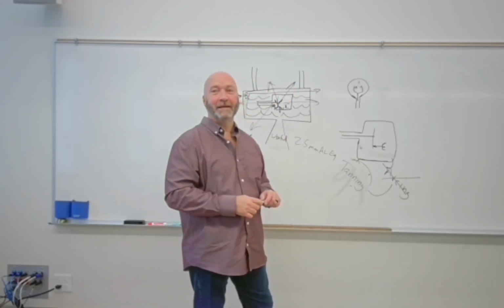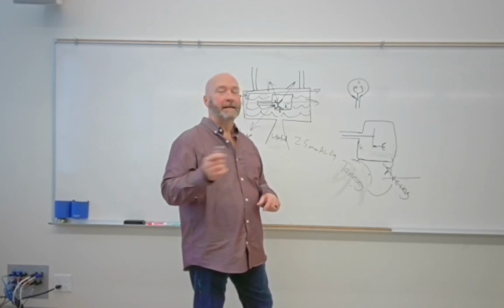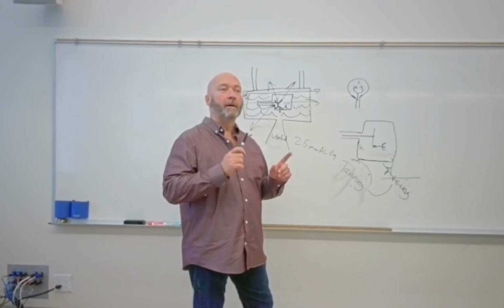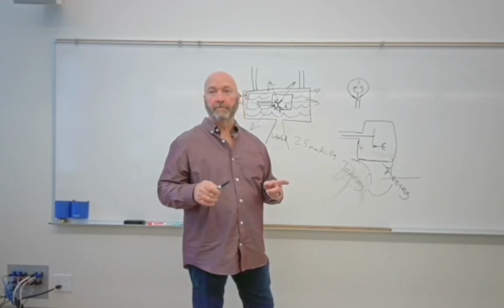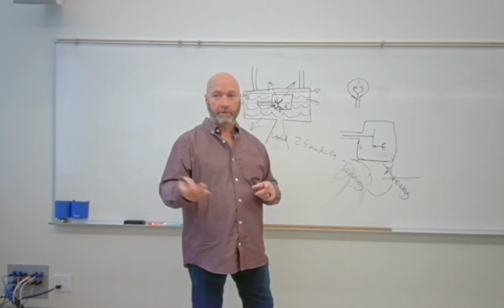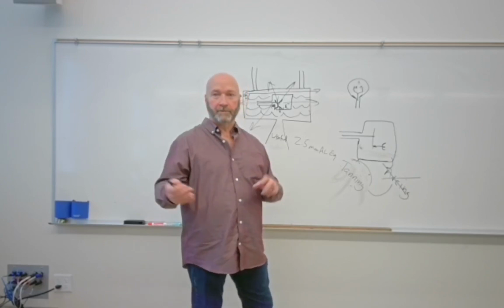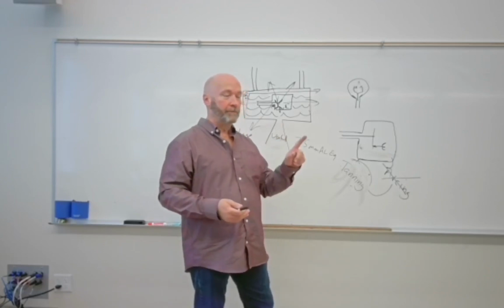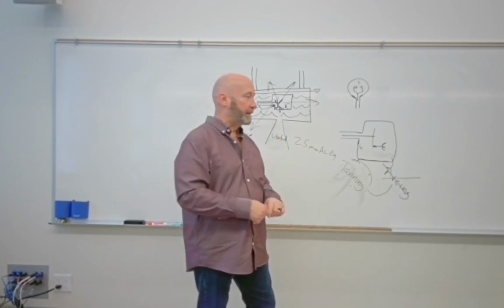And here, the answer is yes, it is. It's added inherent. Okay, so we're going to amend our definition to not just 2.5 millimeters of aluminum, because that's what you have to have in order to make an exposure on a person, but you can't remove it from the system. So two things there. You can't remove it from the system, and you have to have it to legally make an X-ray.